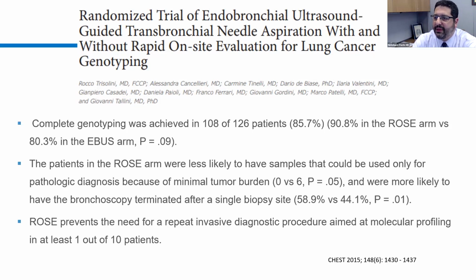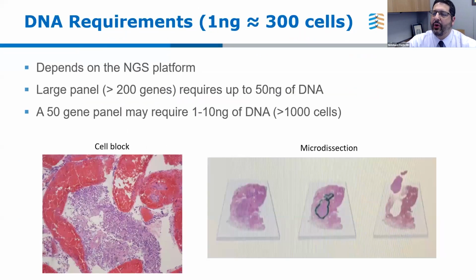And the big conclusion was that 1 out of 10 patients did not need an additional diagnostic test, like a mediastinoscopy or a repeat biopsy, when they used ROSE. So this was a fairly compelling but small study. It was randomized. We'd argue the point that ROSE really is valuable in EBUS, even though it's not necessarily helpful in making a diagnosis.